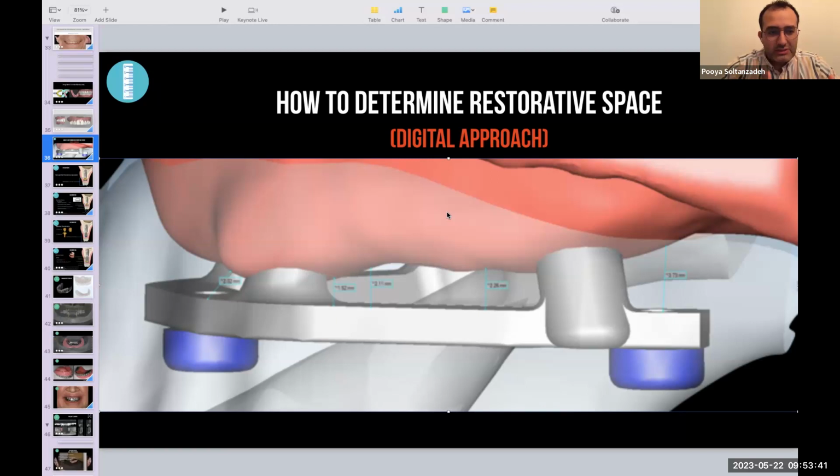But whenever they receive their things, it's going to be accurate because there's no casting anymore. I don't know any lab nowadays that does any casting. Everything is milled, and with milling there's no shrinkage, and it's pretty precise and very accurate. And I'm talking about milling the titanium. Compared to gold, it's cheaper and also lighter. Nobody uses gold. I haven't seen anyone use gold nowadays.